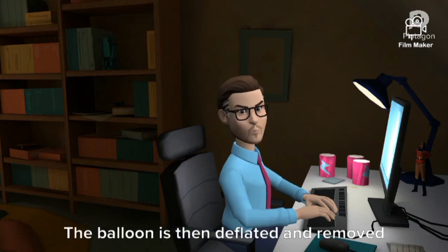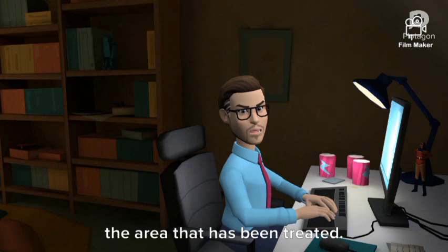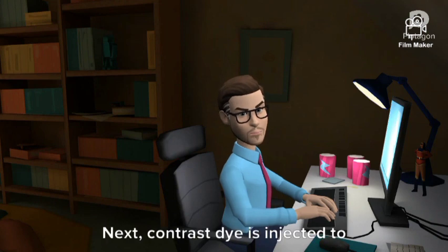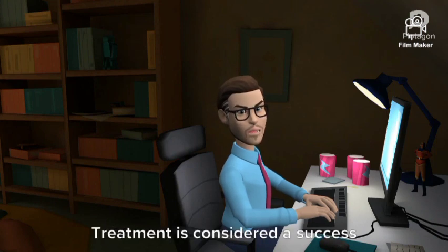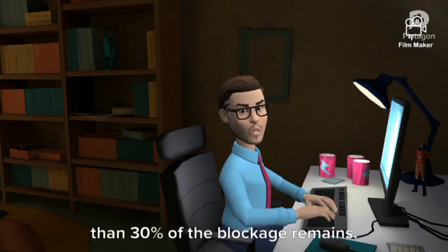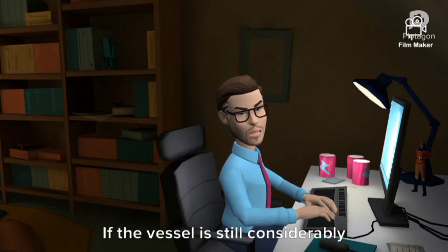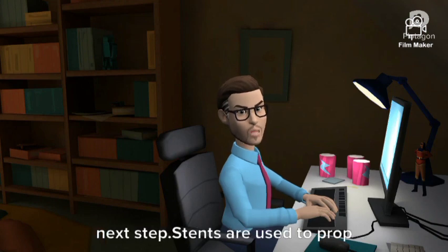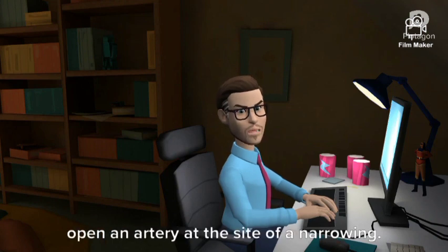The balloon is then deflated and removed while keeping the wire in place across the area that has been treated. Next, contrast dye is injected to assess the result. Treatment is considered a success if blood flow is improved and less than 30% of the blockage remains. If the vessel is still considerably narrowed, placing a stent may be the next step.